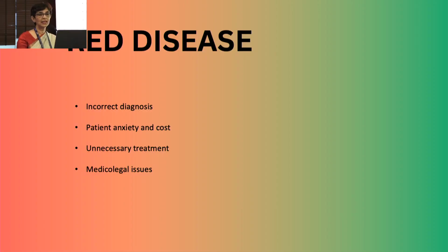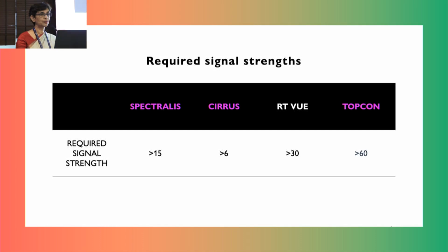It is like a terrified patient coming with an OCT-created damage, which is the red disease. It causes greater patient anxiety and cost, unnecessary treatment with its adverse effects, and sometimes may lead to medico-legal issues. So let us look at some of the causes.